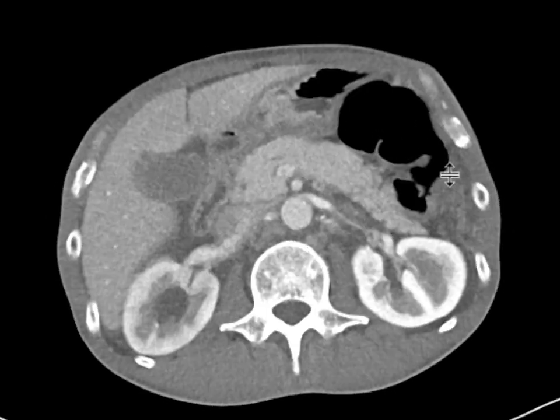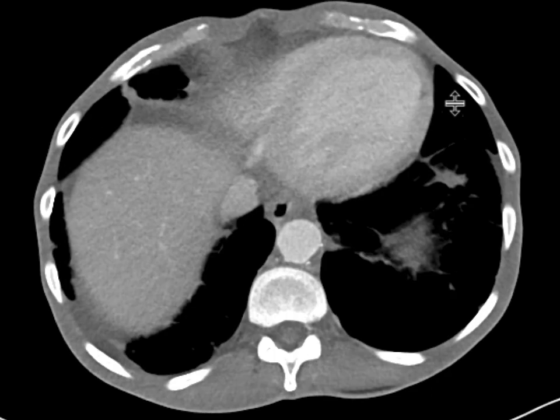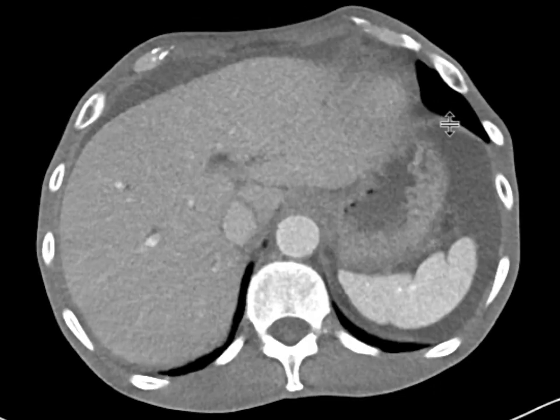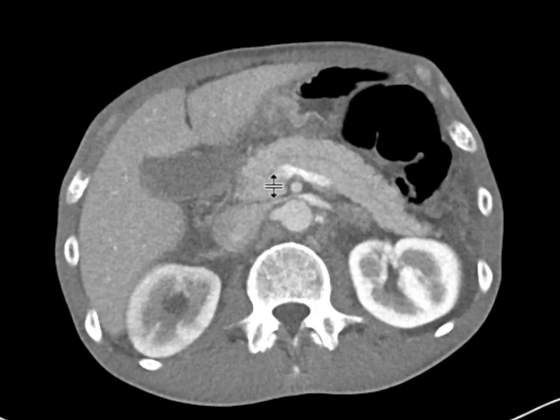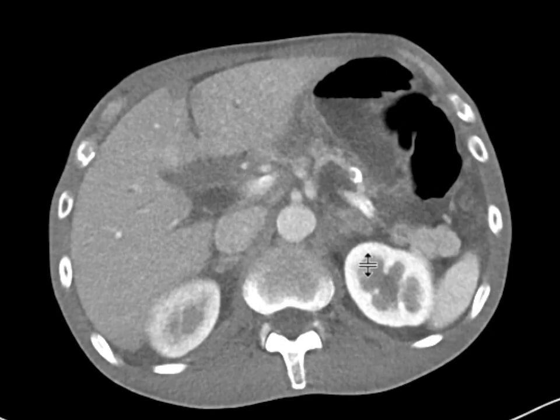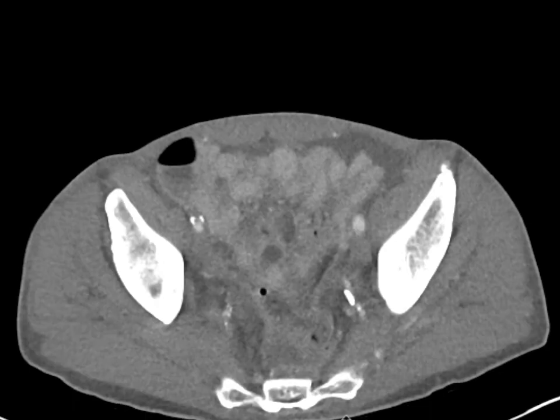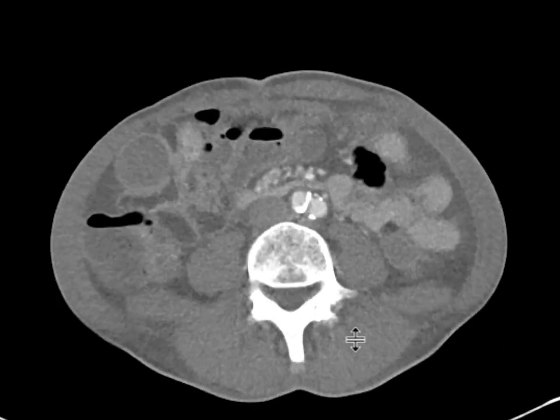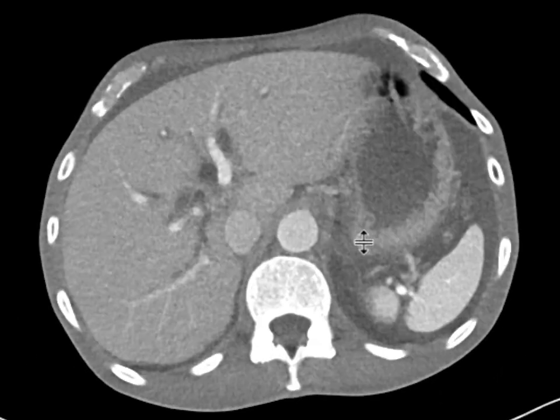These findings are highly concerning for peritoneal carcinomatosis. When I see carcinomatosis, there are a couple of places I like to look in the abdomen and pelvis for a primary neoplasm: certainly look at the pancreas and make sure the pancreatic duct is normal size and no pancreatic masses are seen. I run the colon as well to make sure there are no obvious colon cancers, and in females it's important to look at the ovaries.